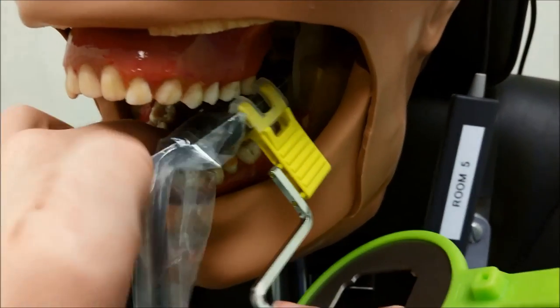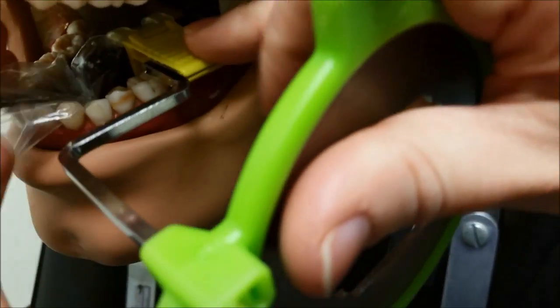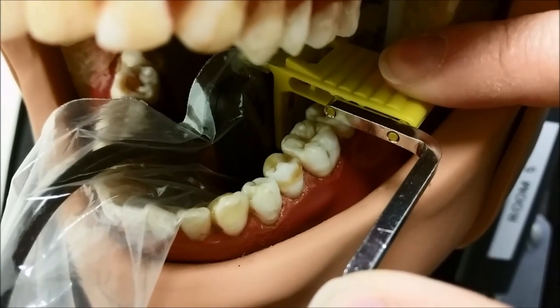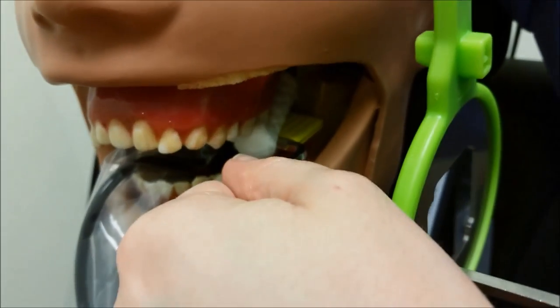Getting the tongue out of the way, you're going to place your instrument. You're going to want to make sure that your bite block is centered and positioned on your second molar. Place a cotton roll and bite together.